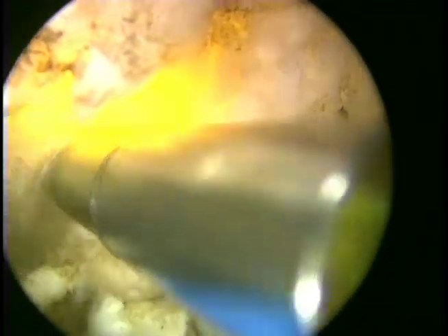Nevertheless, the XPS system can quite easily get through this tissue without any damage to the fiber glass itself due to the internal cooling and the metallic cap, as well as the software for the fiber life, which advises the surgeon of any overheating of the fiber. The very powerful laser, with a nice collimated beam, has good efficiency up to 3 millimeters away from the tissue.